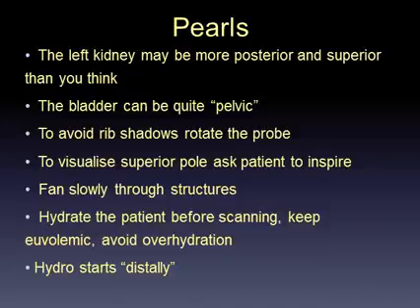Counting to 6 in your head helps, 6 seconds being the typical length that an ultrasound scanner will record a clip. You can hydrate the patient before scanning if you're looking for hydronephrosis. Keep them euvolemic.